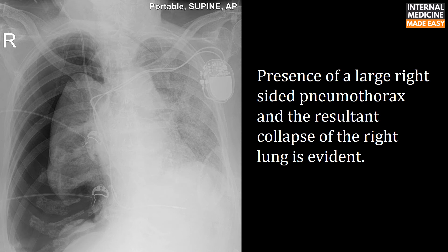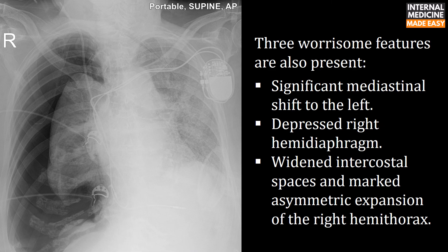In this X-ray, the presence of a large right-sided pneumothorax and resultant collapse of the right lung is evident. Three worrisome features are also present: significant mediastinal shift to the left, depressed right hemidiaphragm, and widened intercostal spaces with marked asymmetric expansion of the right hemithorax.